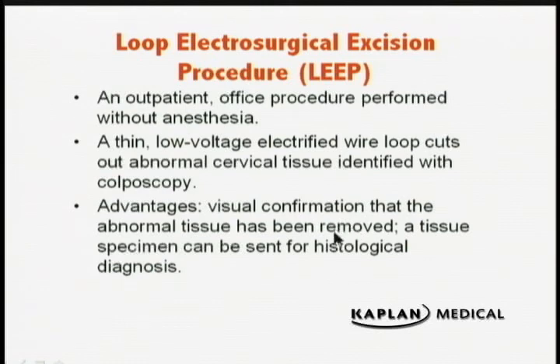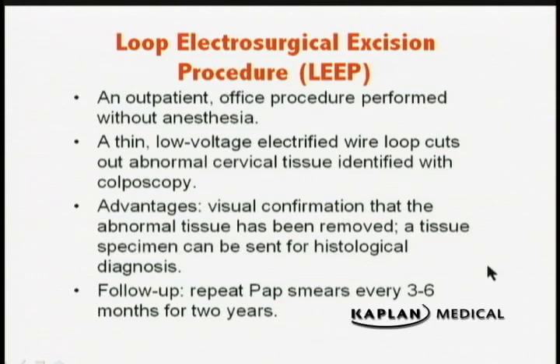And that is different from the cryotherapy, where you don't know if it's been removed because you freeze it. Then you can take the tissue specimen, send it for histological diagnosis, and the pathologist will tell you what is the nature of the lesion, did you get it all out, are the margins clear. Anytime you do a LEEP, you must do follow-up pap smears every 3 to 6 months for a couple of years before you can say that there's no recurrence.